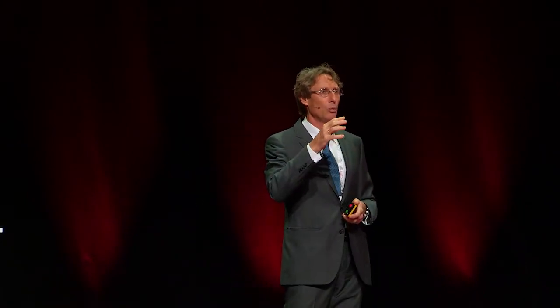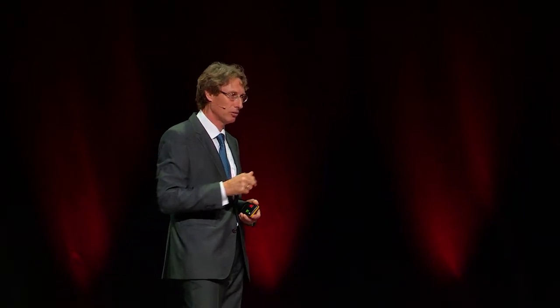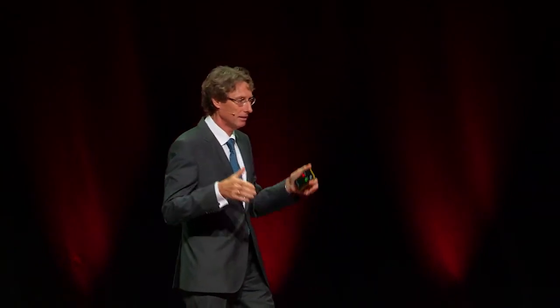In 2 cases we replaced a ceramic fused to metal restoration with PEEK because we had implant loss, we had fractures of the ceramics, and it was really a nightmare. And now these patients are stable with the PEEK framework, and they are really happy. And a total of 96 implants, so you see we generally do all on 4 or all on 6 solutions. We have an average observation time of 56 months, that is 4 years or nearly 5 years, and the maximum is, as Marcus told before, nearly 9 years, and the minimum was 1 year and 2 months, and that's the state of the data end of December 2016.